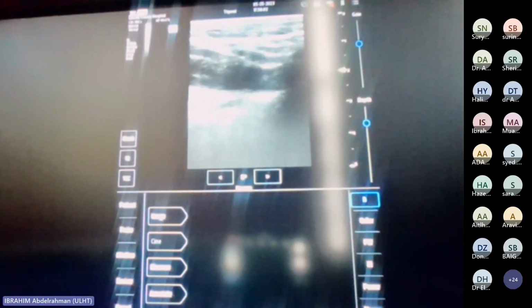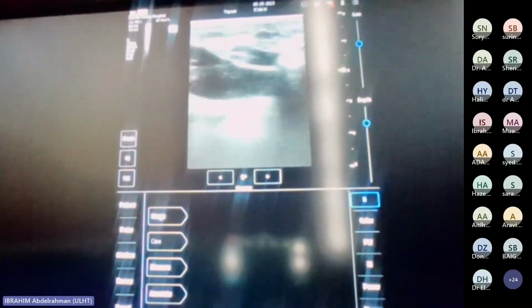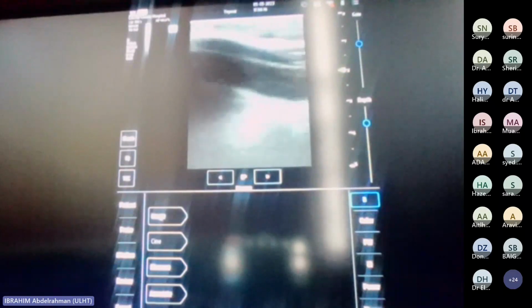So if you're thinking, okay, which am I going, anterior or caudal, or cranial or caudal, just move it and you will know. So just slide the probe up. So you're going towards the chin. So that's cranial.